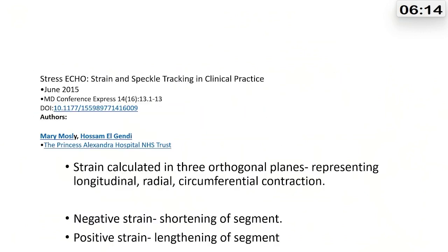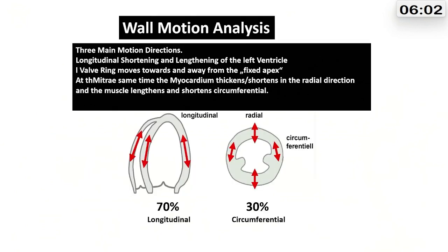So let's move to the strain. In my place, we have done loads, and we actually published chapters in books about strain and speckle tracking in the context of left ventricular function. I know not all of us have done strain. In simple terms, strain is something your eyes cannot catch because it depends on the longitudinal function. Your eye can catch only the side to side. I don't know what your favorite movie is, but if it is Game of Thrones, you will just see a movie. But if you watch a Charlie Chaplin movie from the 1920s, you will see pictures one after another quickly, because your eye can catch this. So for longitudinal strain, you depend on the computer to tell you what your eyes cannot see, and it's very important.